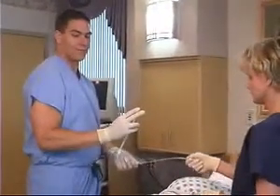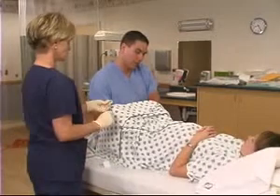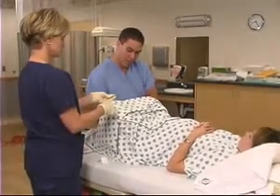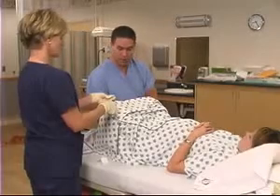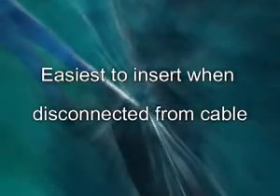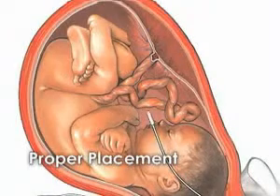Place the catheter introducer between the fingertips, and once the cervix is reached, advance the Koala through the introducer into the amniotic space. Be careful not to advance the introducer past the opening of the cervix. Remember, it is easiest to insert the Koala when it is disconnected from the reusable cable. Correct placement of the catheter should be within the amniotic space.